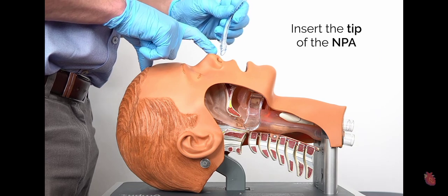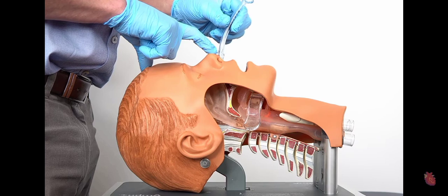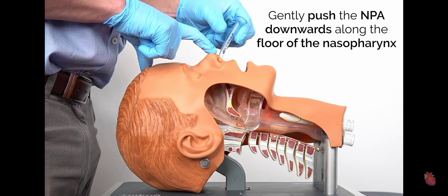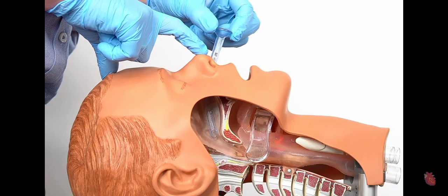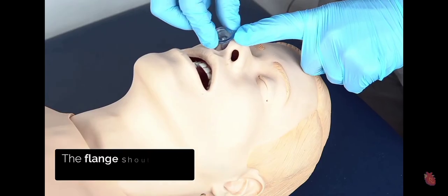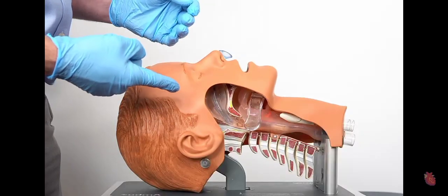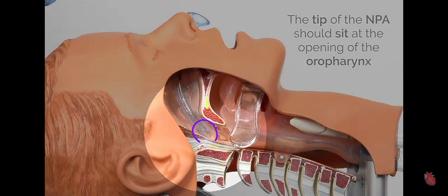Then we're going to gently insert the tip into the nostril, and I'm heading downwards, gently twizzling the tube, letting it gently seat itself in. I'm going to keep pushing, gently twizzling until the flange sits comfortably on the outside of the nostril. You can see in the side cut where the tip of the tube is. If the tube was too long, potentially the patient may start gagging or coughing, in which case you'd remove the tube and replace it with a smaller size.